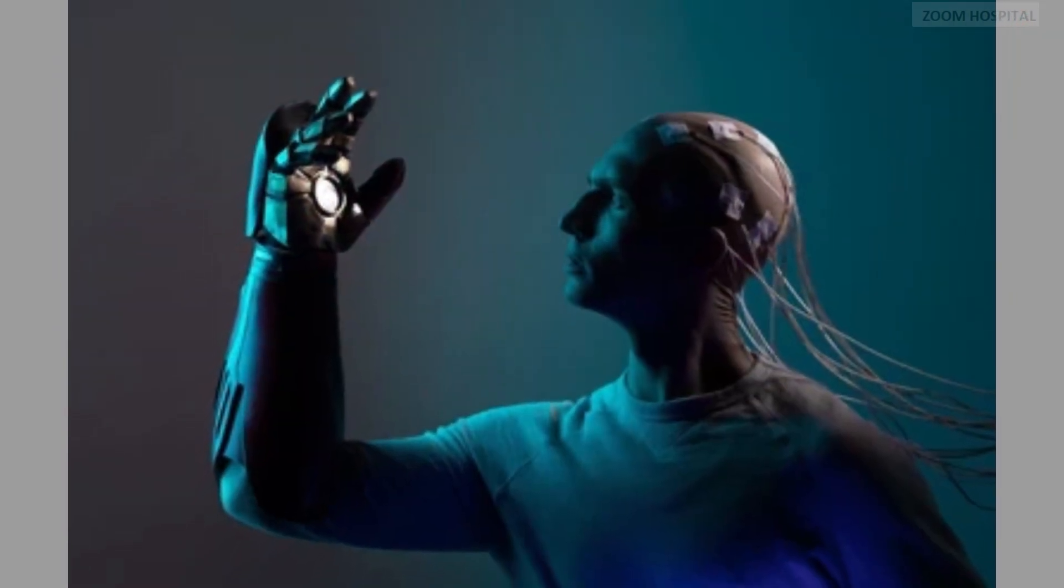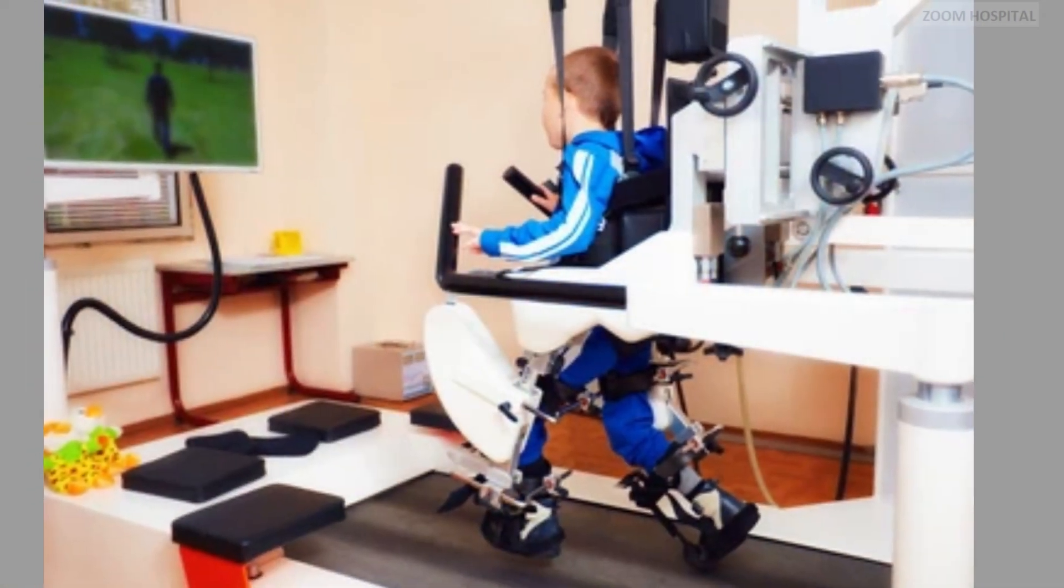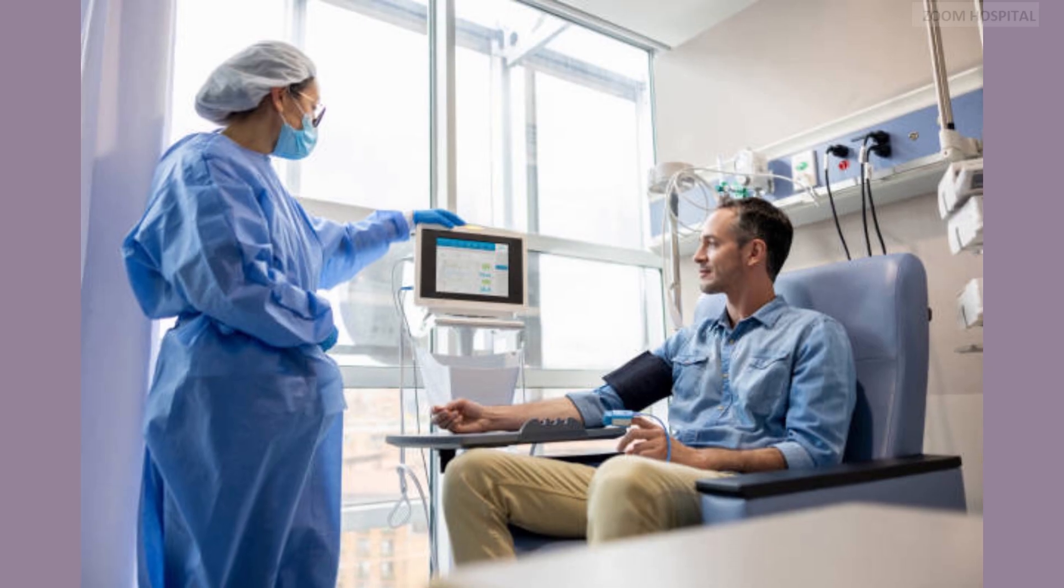While several other companies are working on innovative products in the field of brain chip implants, Neuralink stands out by joining a limited number of companies that have successfully implanted such devices in humans.